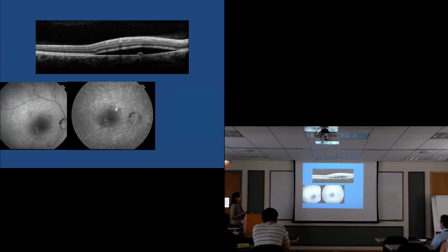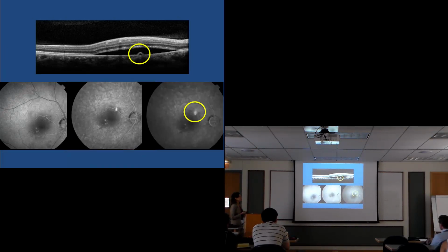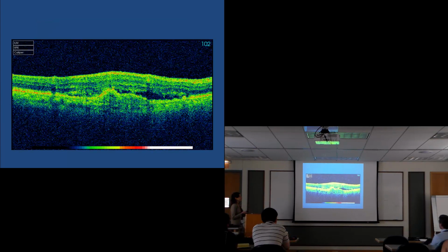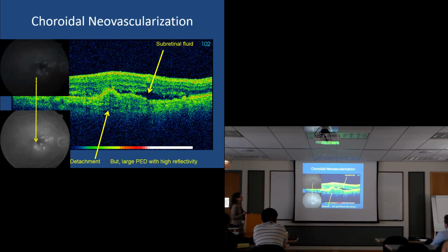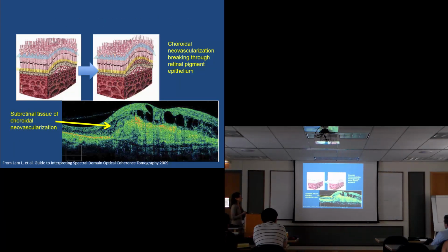We have features on OCT because of the size of that lesion and the amount of fluid. This is different, and this is a much different diagnosis. This is AMD. So same fluid, same blip in the retina, different proportions, and instead of just fluid, we think that there's really a choroidal neovascularization, or new vessels growing up here to invade. And these patients, they don't self-resolve. They could be permanently scarred, and this is why patients lose vision from macular degeneration. So just the difference in the morphology, those are the subtle differences that give you a whole different diagnosis.